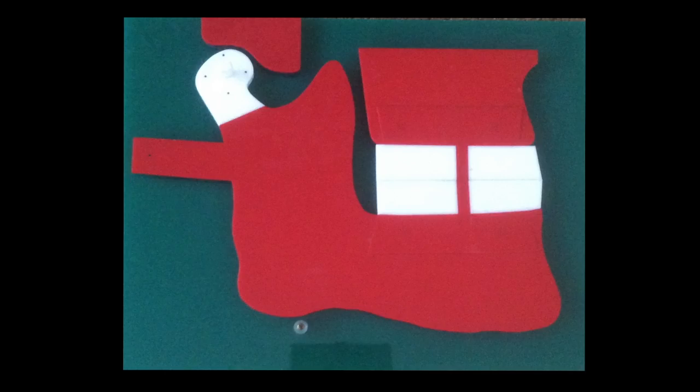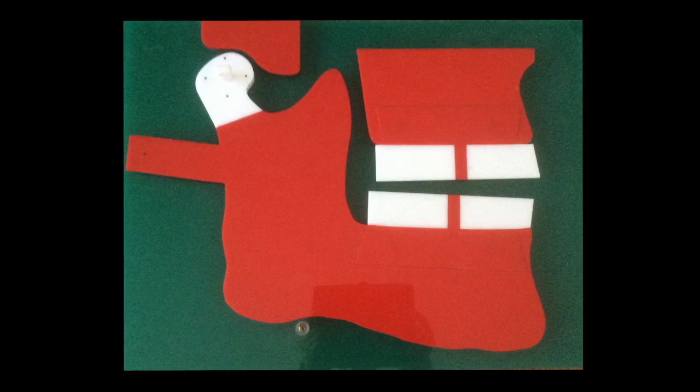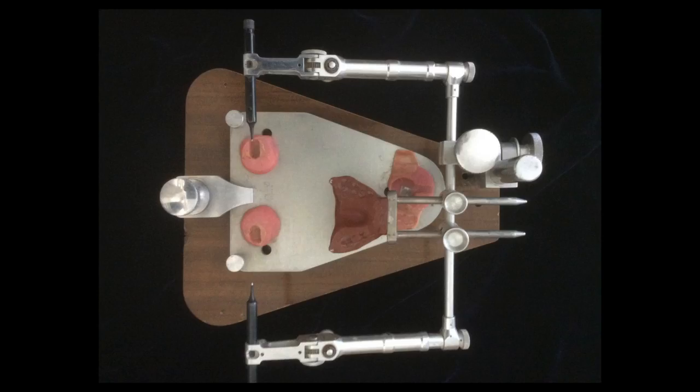After the lower cast is mounted, we then close the articulator to occlusion. If the axis of the articulator is not the same as the patient's axis, then the occlusion which we observe between the casts is not really what the patient's occlusion is. The ear bow face bow, which is the commonly used face bow today, is an approximation of where the axis hopefully is. This is the adjustable face bow and mounting jig which my dad designed and we used routinely.